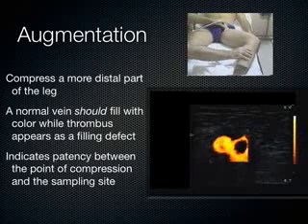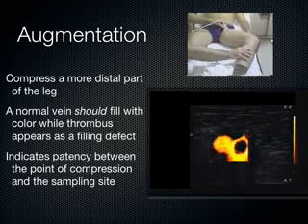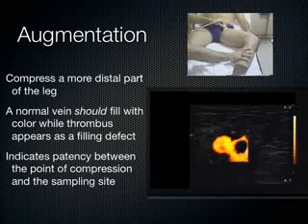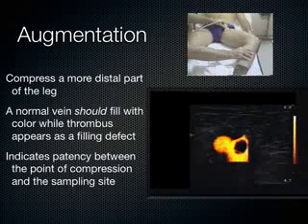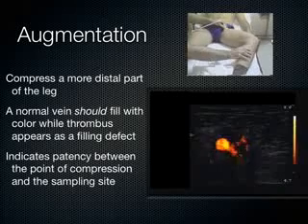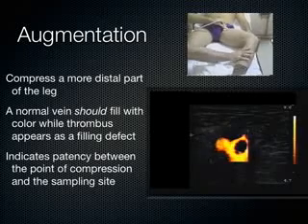It's really only the grayscale compression alone, the 2D ultrasound image, no color involved, that rules in or out the DVT. There are lots of other color techniques that don't stand up under clinical conditions, so you can't really use them. Even though today we'll probably be doing it because it's fun to see the anatomy link up that way. I think that's cool to show you, but diagnostically it's not useful.